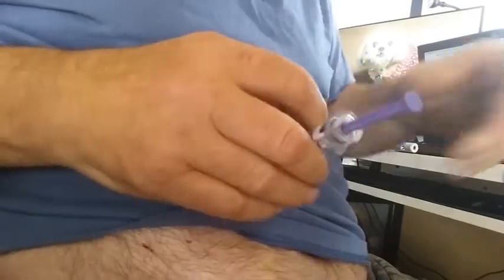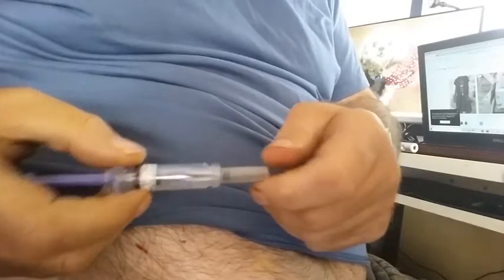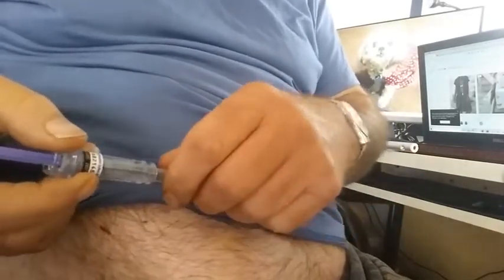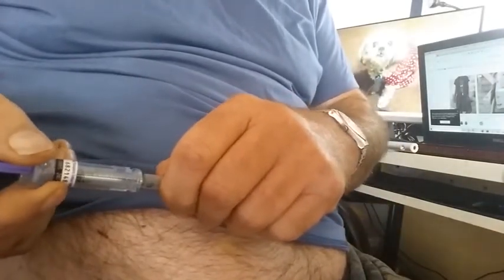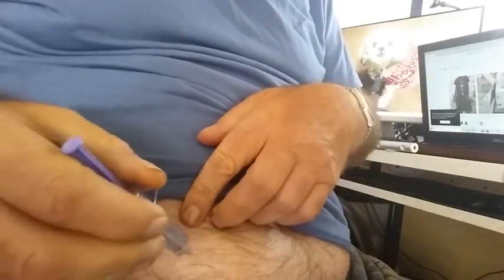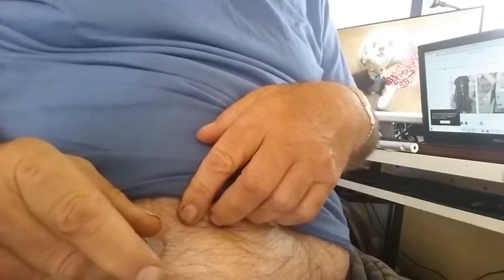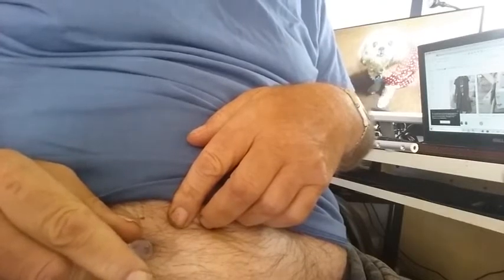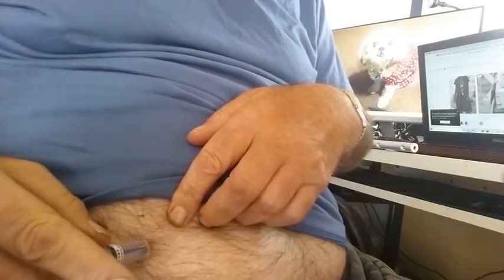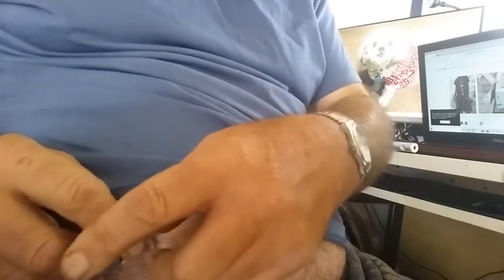So now I'm pulling out this other one, the purple one. Again, it's similar. It's got a different colored plunger, and hopefully you can get a better shot. So I'm going to pull this off. It's a little stiff. Set that up there. Again, the needle. The bubble in there or whatever, don't worry about that. Just put it right in there, and you can rotate that around your stomach each day if you have to do it for a week or so. So I push that in there again, and got it all in there.